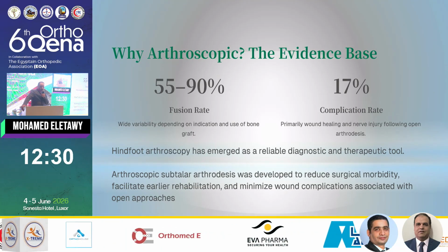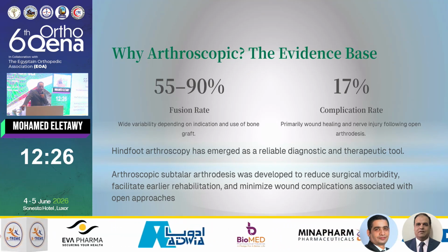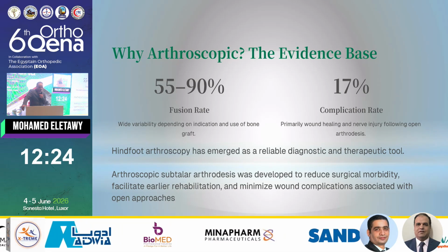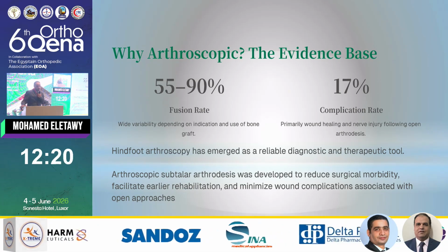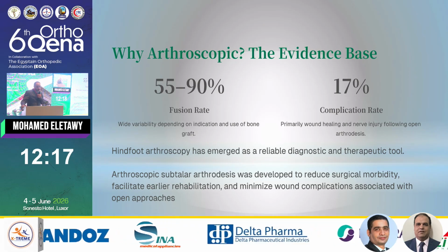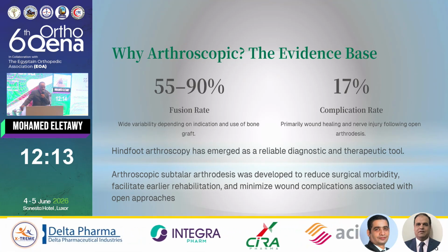About 17% have a complication rate in open surgery, in the form of wound healing problems and nerve injury, and also only 55 to 90% have a fusion rate. Hindfoot arthroscopy has emerged as a reliable diagnostic and therapeutic tool.